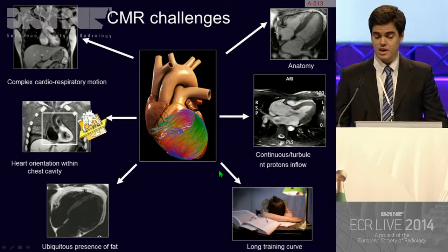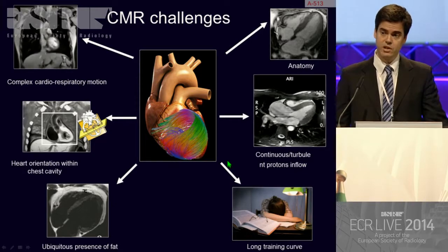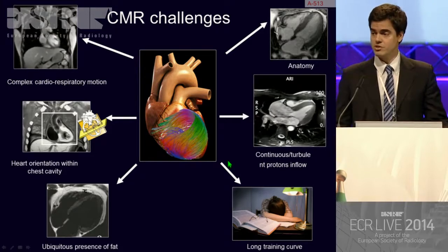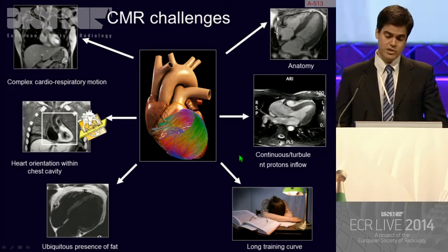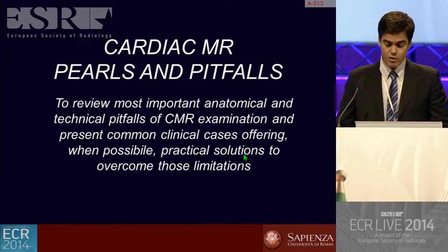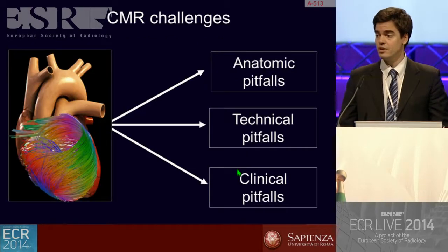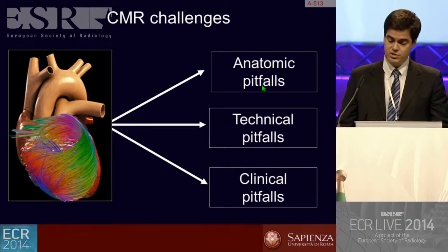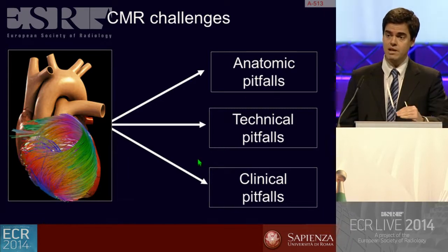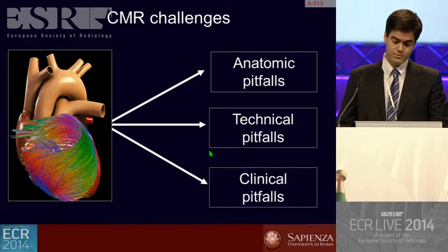And finally, this is another point that probably represents the major pitfall of cardiac MR, for radiologists and for cardiologists: it certainly requires a long learning curve because it is really a mixture of clinical and technical information to rely on. So I will try to review the most important pitfalls of cardiac MR, offering, whenever possible, some practical solutions to overcome these limitations. I organized my lecture, as shown here, into anatomic pitfalls, technical pitfalls, and clinical pitfalls. This is the pathway and the agenda I will try to discuss in the next 45 minutes with you.